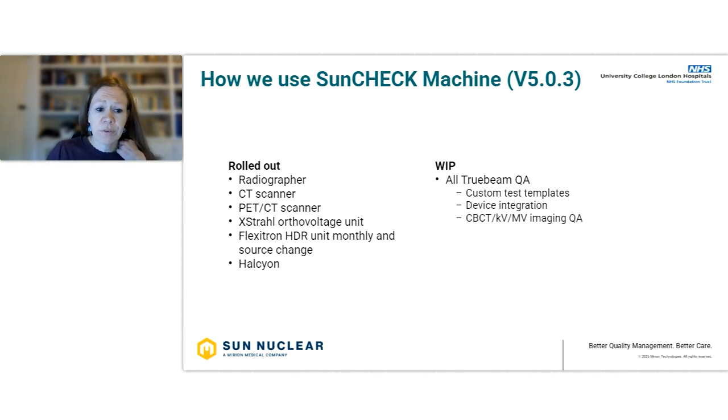So we're using it for all of our QA, just about to roll out the last module for our TrueBeam QA, which might seem counterintuitive, like why didn't we start with the TrueBeams rather than all the rest of it?